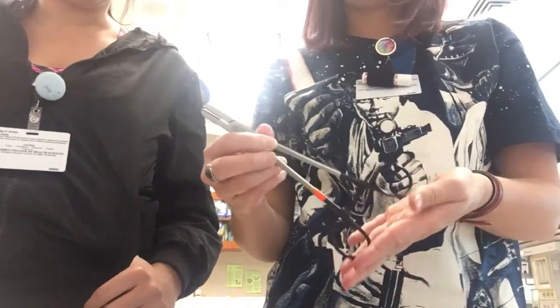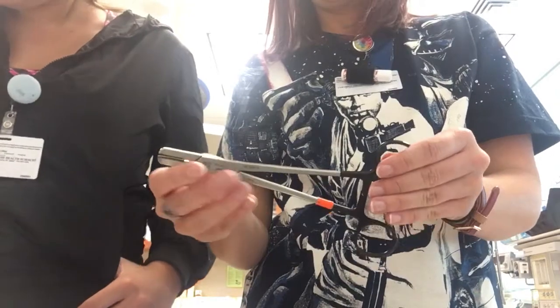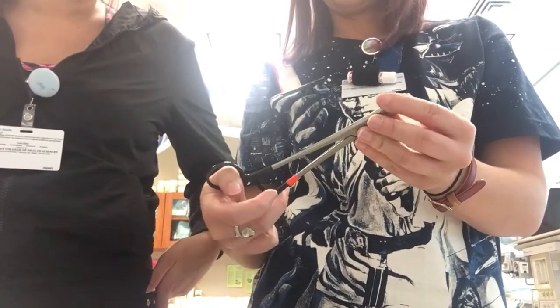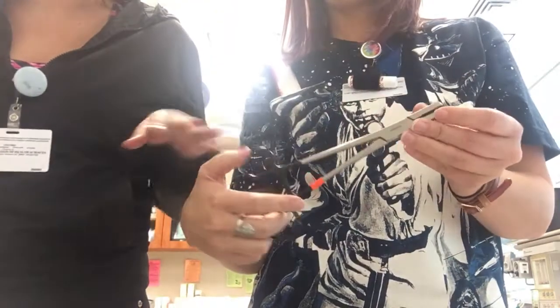And then we have a chubby needle holder — very chubby right here. It's not actually used for holding sutures, I think she said. But it's just called that. That could be wrong too, so just take it with a grain of salt.